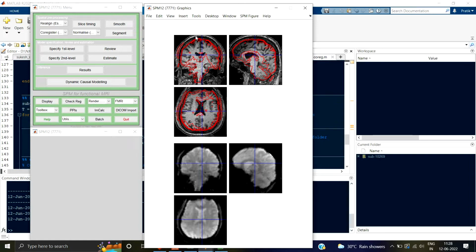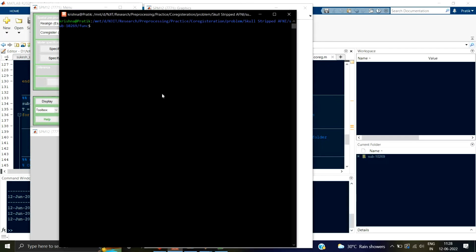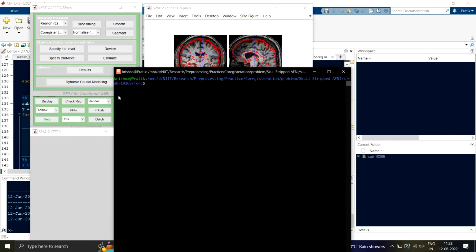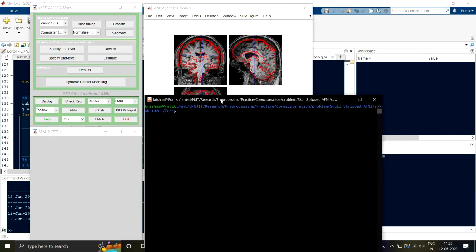So I'll first show you how you can actually remove this skull. I'll show you two methods, one with FSL, the other with AFNI. So let's first see how we can remove the skull with FSL. Here I'm in my WSL. FSL and AFNI only work with Linux, so for that you'll have to install WSL. And in the WSL, go to the path wherever this particular subject is.